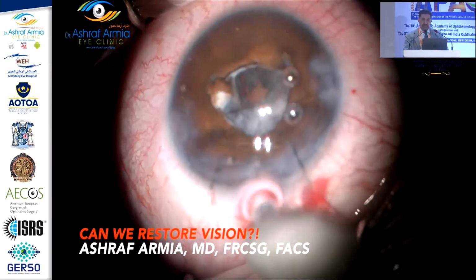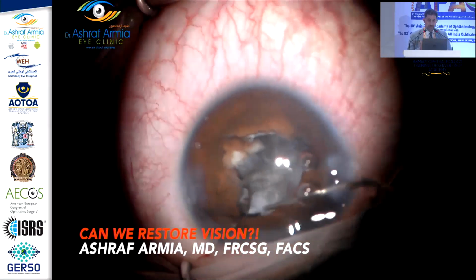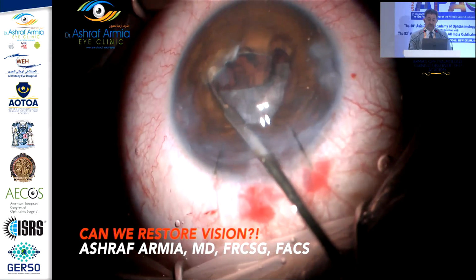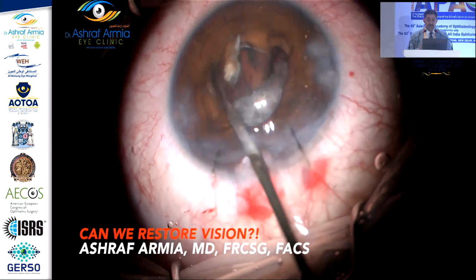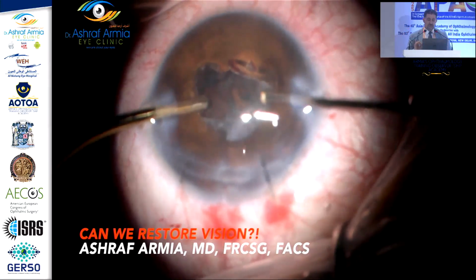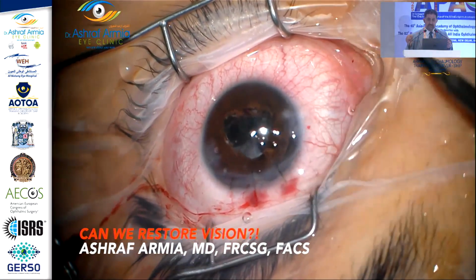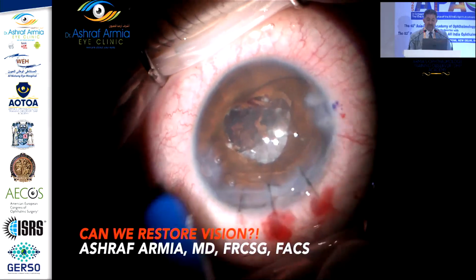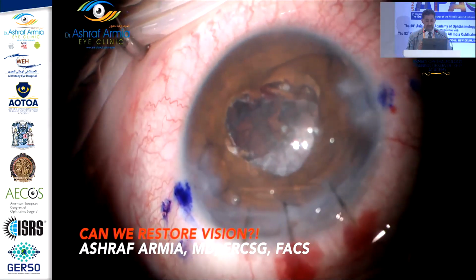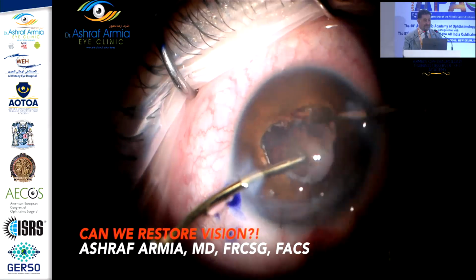Now I'm seeing red reflex, but red reflex means either there is an open posterior capsule, or there is no bag, I don't know. So I'm trying again to find a space, because I need an IOL to be placed inside. And I rarely go for scleral fixation unless I lose the bag. I do whatever I do to preserve the bag, because I believe that it is the physiological place for the IOL. So I felt now that I may lose the bag, so I put my plan for Yamani, but still I'm hoping for the bag.